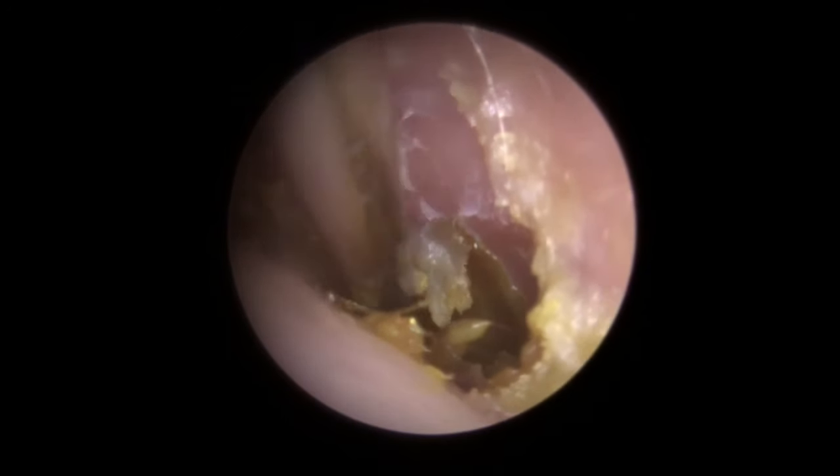I'm trying to get a bit of traction to this bottom section here. This is actually tucked into that valley — so it's coating the valley, the canal wall, and the eardrum. I'm really trying to get this peel without causing any discomfort for the patient, and more importantly without causing any damage to the eardrum at all. So I'm just going back in now, aiming for a slightly different spot — see if we can peel from the top left down. Normally I would hold on to the top section and pull downwards, but that little ridge is proving really difficult to get past to get the angle I need. So what I've done is I've actually doused this with olive oil — I want to try and soften this last section and really loosen it from the eardrum.